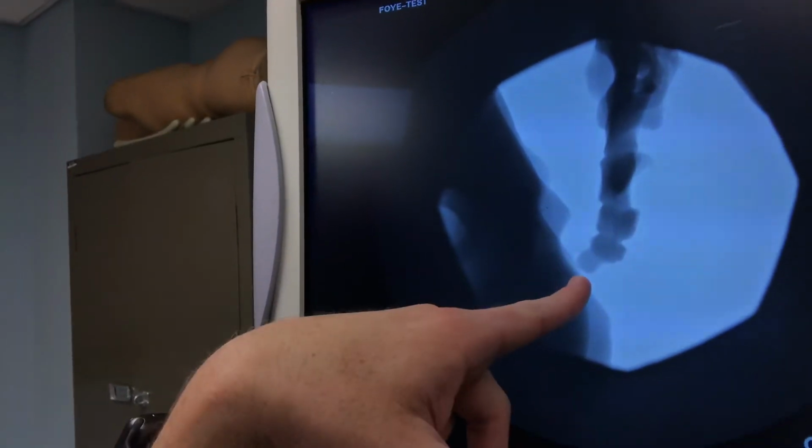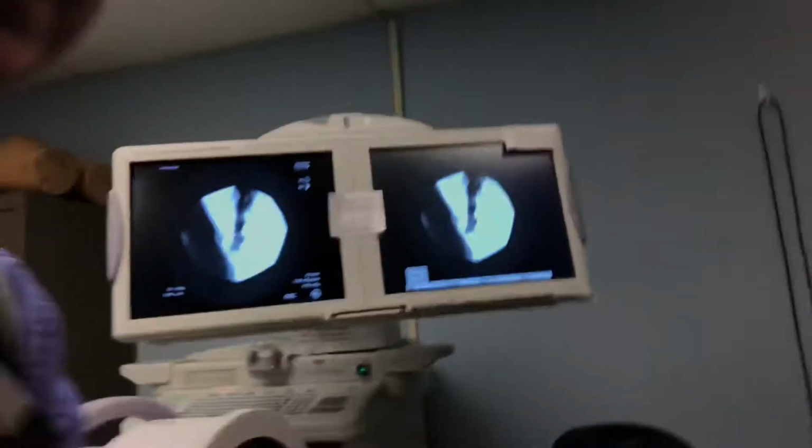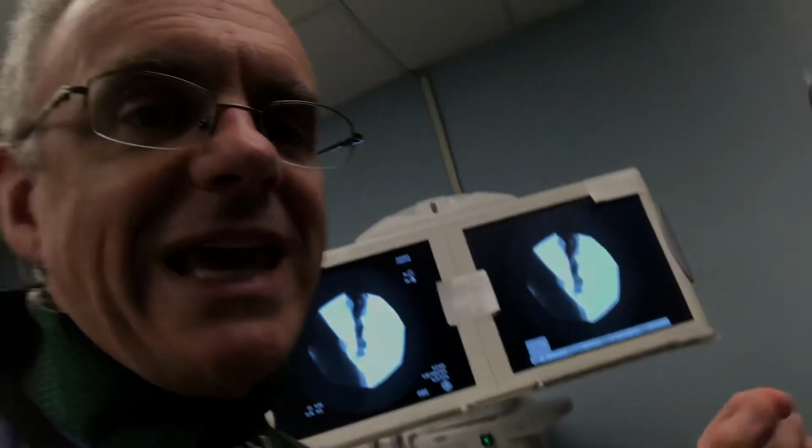So you can see how, by seeing the details up here, as the physician treating the patient, when I'm doing the injection, it's a very small injection. It's not a very deep injection at all because the coccyx or tailbone is very close to the skin. I can make sure that I place the needle specifically at the joint or bone or abnormality in question, so that I can be confident that I've gotten good coverage at that area.